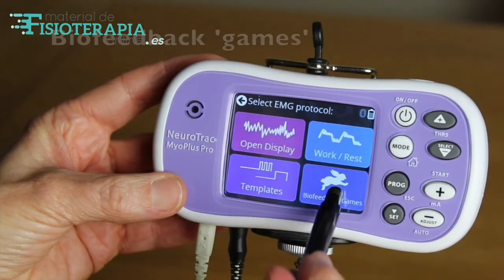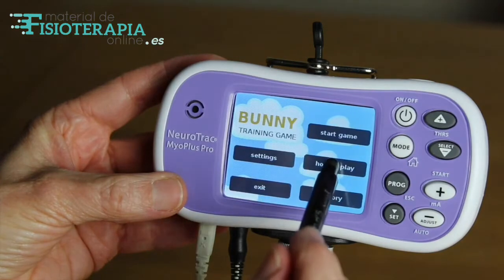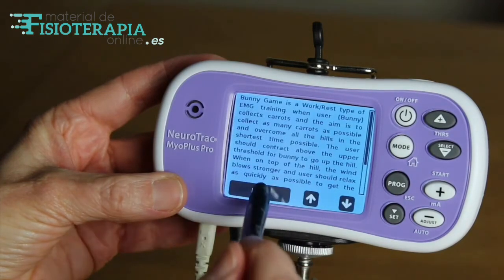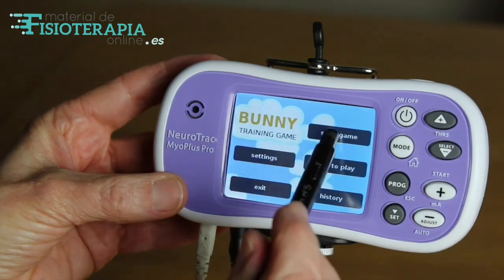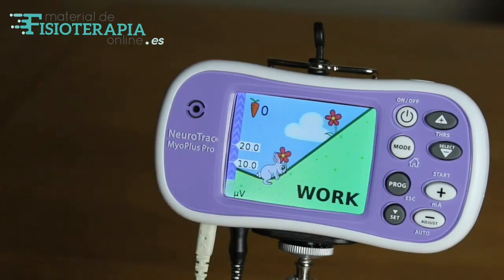Going back to the home screen, we can see there are biofeedback games which can be fun and help compliance, especially in children. Each game has clear instructions and can help to train muscle strength, coordination, and encourage complete relaxation.